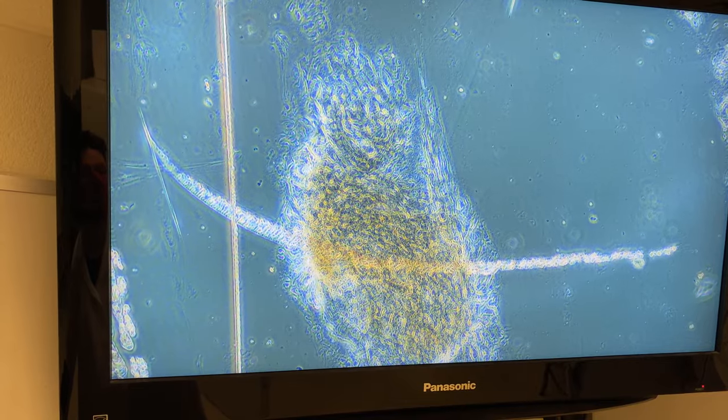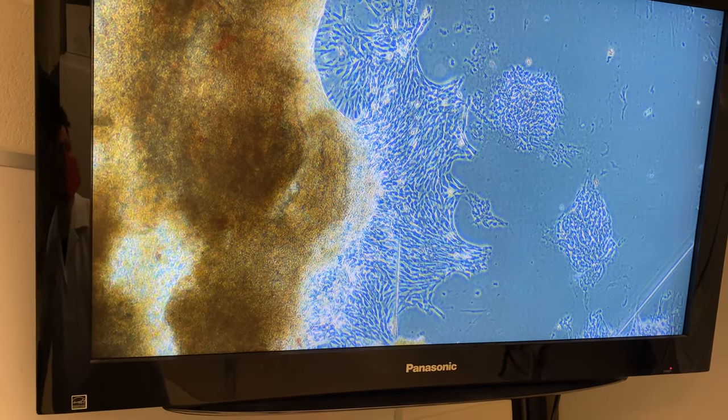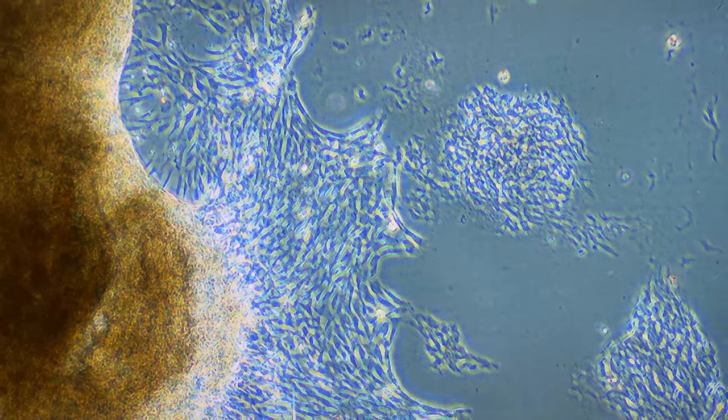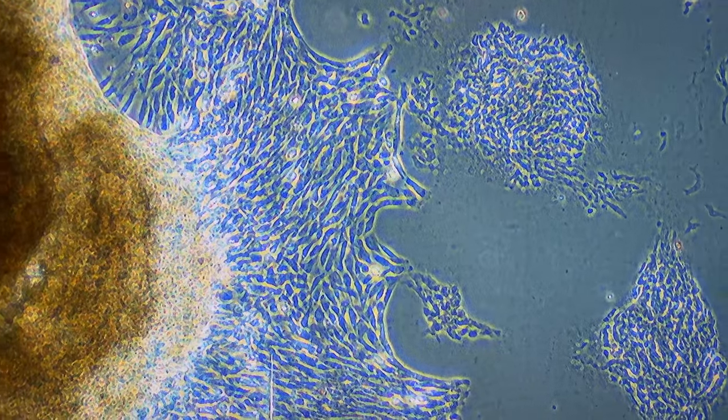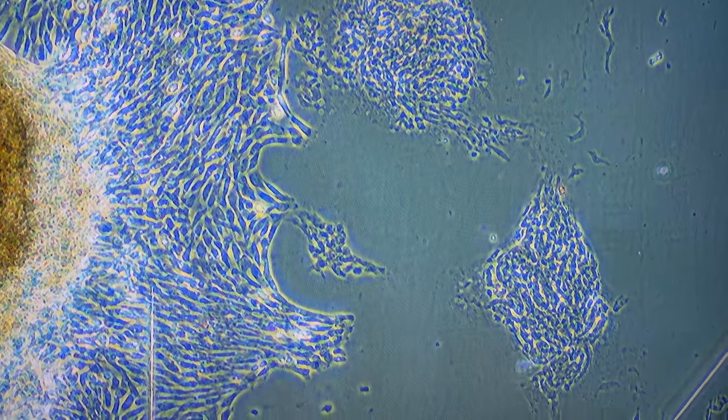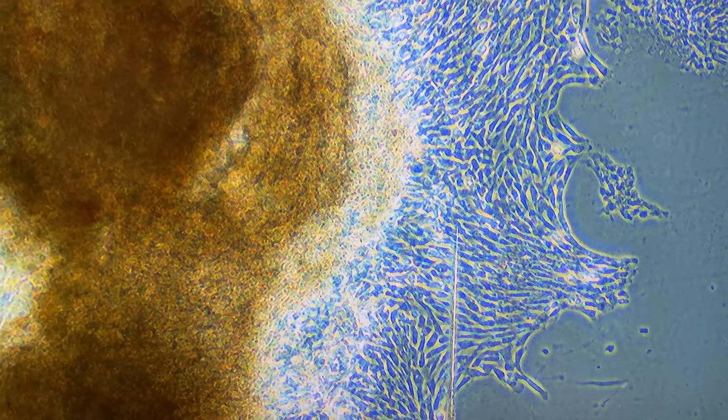The explant should look darker because it's not a single layer. Individual cells should look clear, and healthy cells should look elongated. Here's an example of a large explant, and you can see the heart cells have migrated away from it. What we'll do is sterilize forceps, remove that explant chunk, leaving behind the single monolayer of heart cells. We'll then continue to culture that, giving us our single layer of cells.